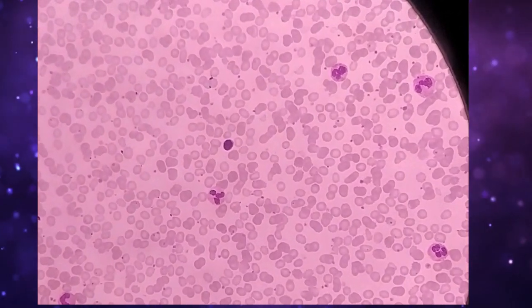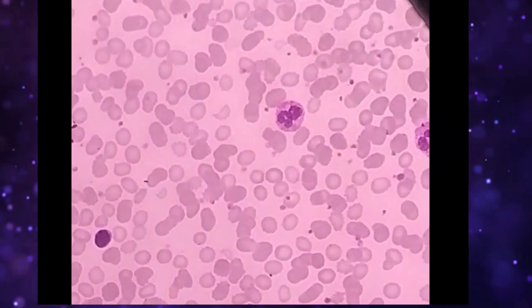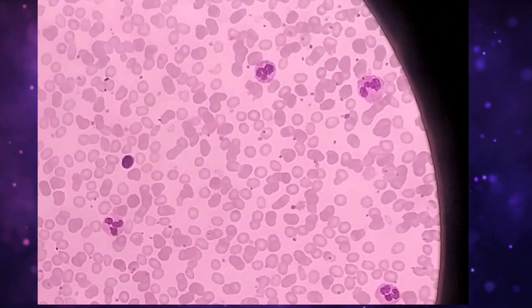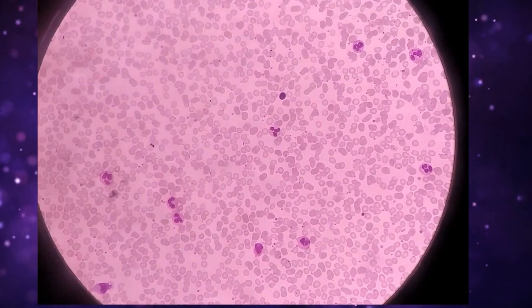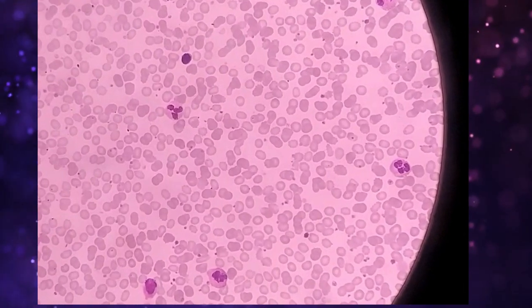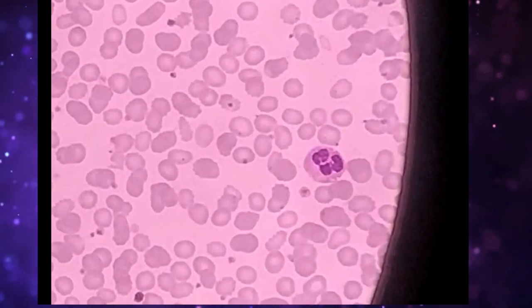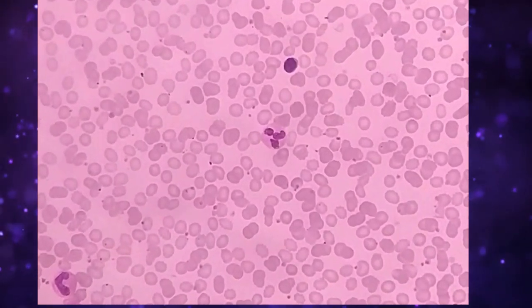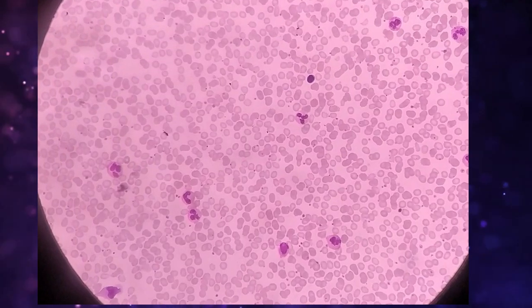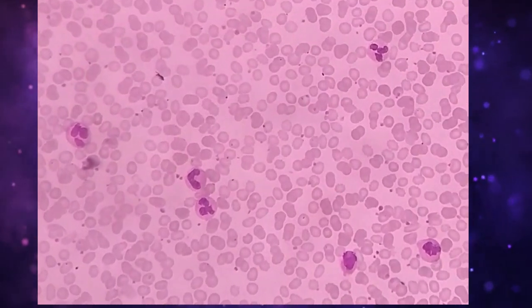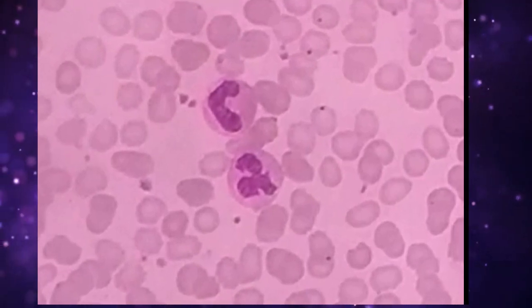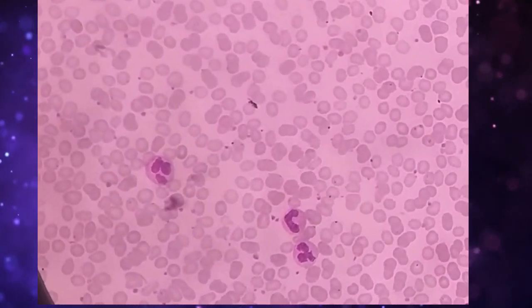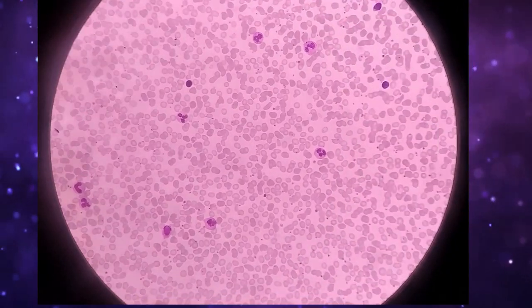Let's see one by one. This is a neutrophil. This is the second neutrophil. This is the third neutrophil. This is the fourth neutrophil. This is the fifth neutrophil.